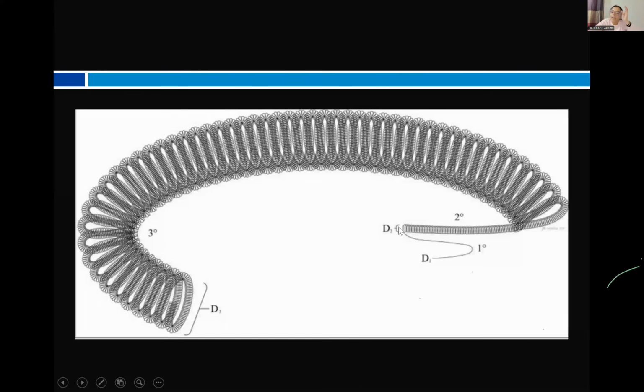And actually, the coil also has a primary configuration, which is not taken into account in measurements, but it decides the stiffness of the coil. If you pull this secondary structure further, it is going to turn into a very, very thin core wire. But what you have to know is the diameter of the tertiary structure and the diameter of the secondary structure, which decides the coil size.